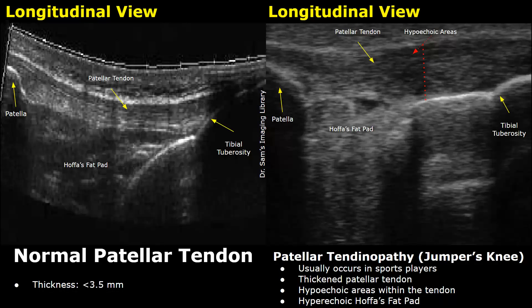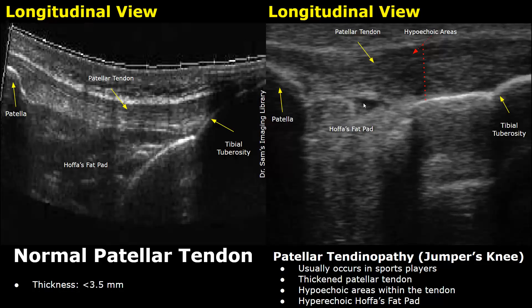Hello everyone, this is Dr. Sam. This video is about patellar tendon ultrasound. We will compare the normal ultrasound image of the patellar tendon of the knee with patellar tendon pathologies, mainly including patellar tendinopathy, which is also known as jumper's knee. It is an overuse injury of the knee and it usually occurs in sports players.